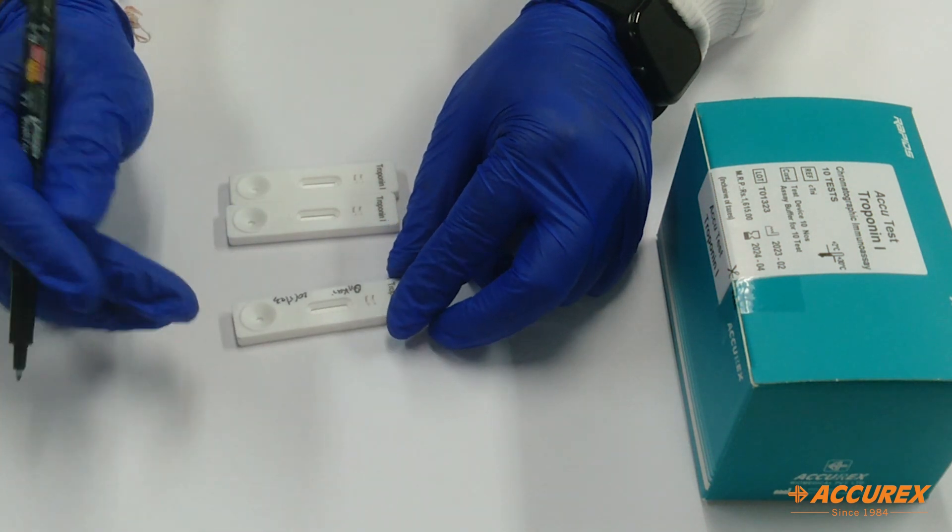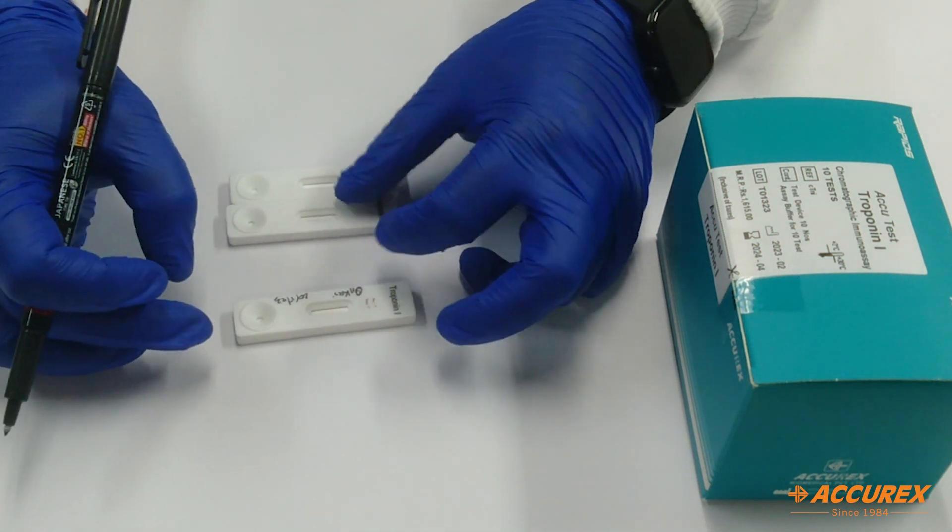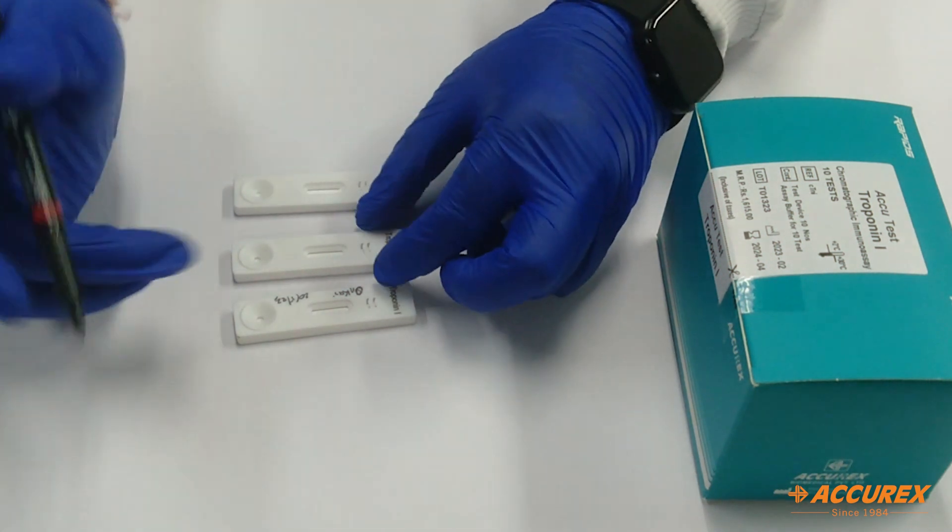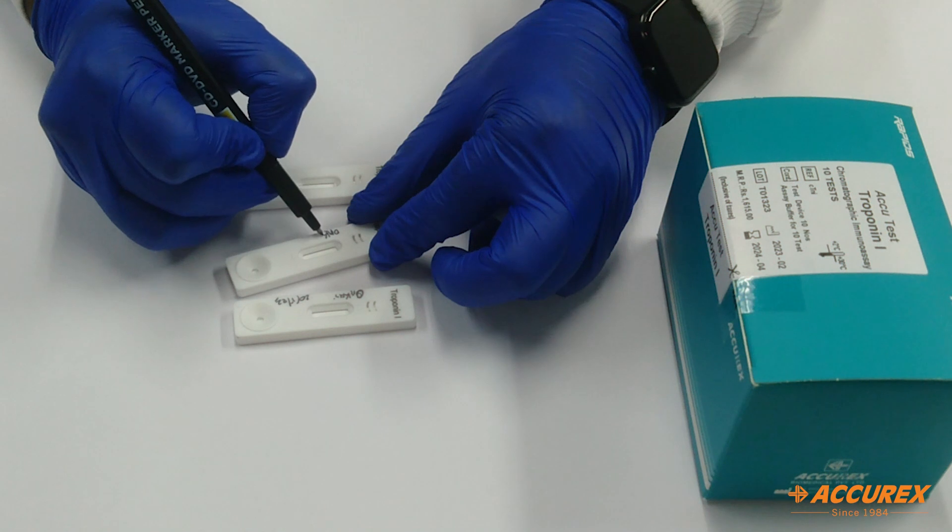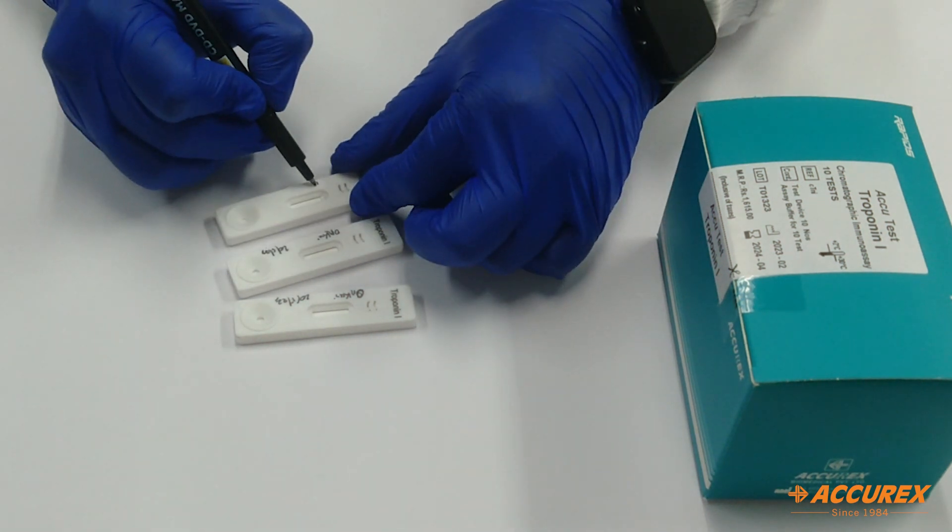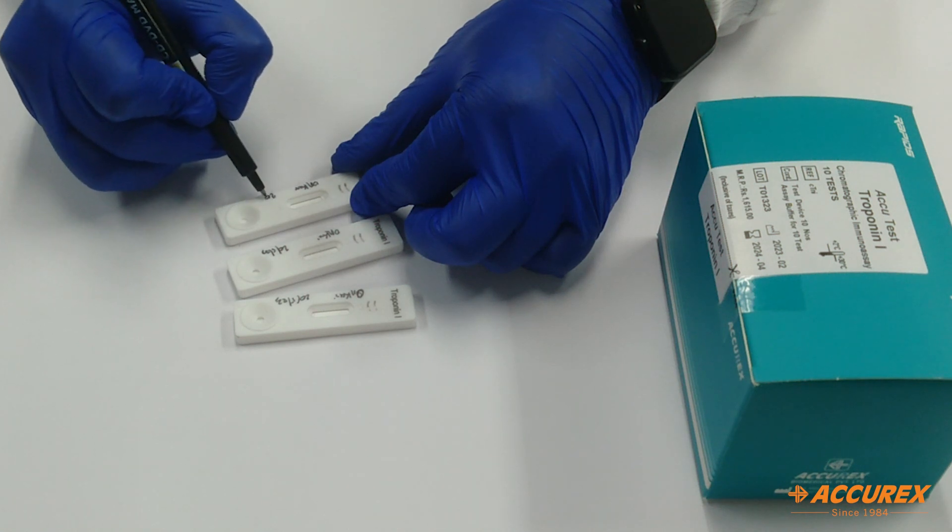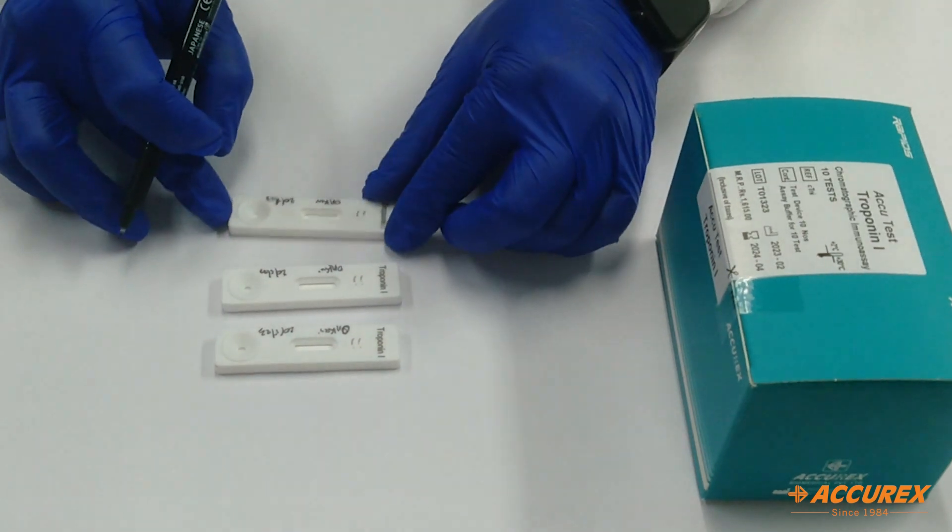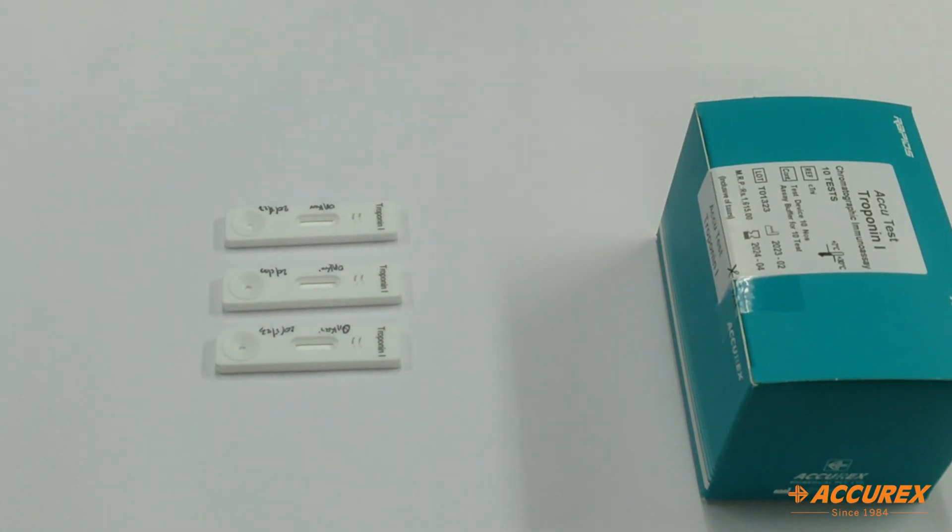I'm writing the patient name and date. Here I will be doing the testing with serum, second with whole blood sample, and third with finger prick. One by one we will see how to use it.